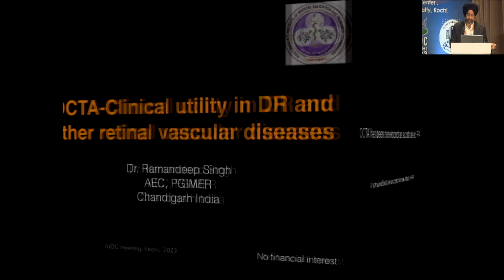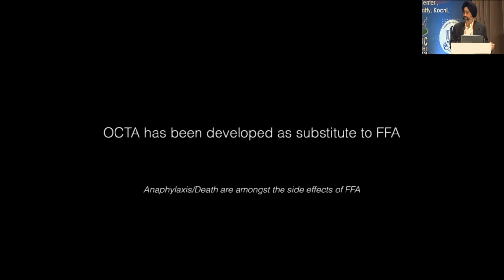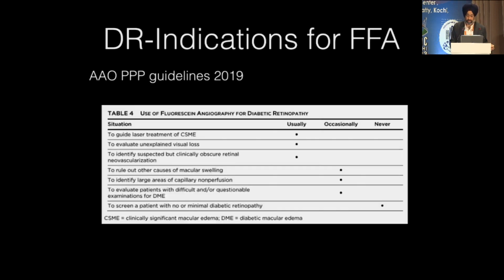The utility of OCTA in this setting. OCTA has been developed as a substitute to FFA. It was always thought that FFA had serious side effects, though rare, so OCTA has come up to substitute the FFA. And going straight to my topic.